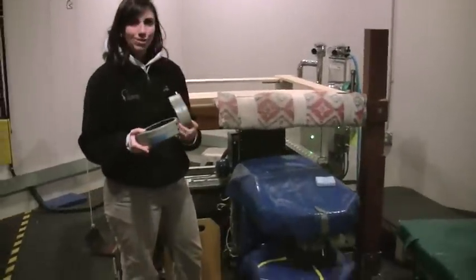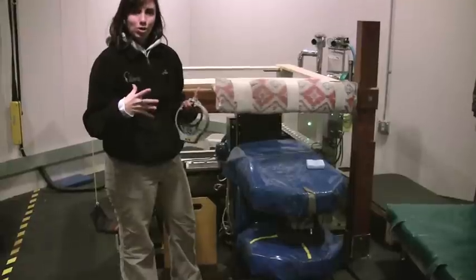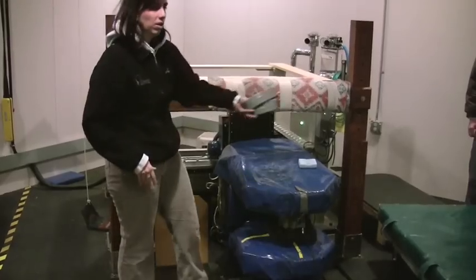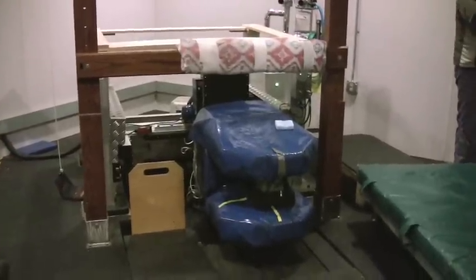We've had one horse that we weren't sure we were going to be able to scan. It was a draft horse cross, and her feet were so big we weren't sure if she would fit in the actual coil. We usually fit in the magnet, but we got her done. She was the one that didn't want to go in. But that's basically the setup for general anesthesia.